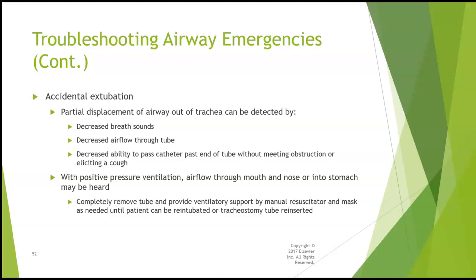If you believe that there's a partial extubation or a displaced tube, then you want to make sure you're completely removing the tube, providing ventilatory support with a manual resuscitator and mask, and evaluating the patient to see if they need to be reintubated.